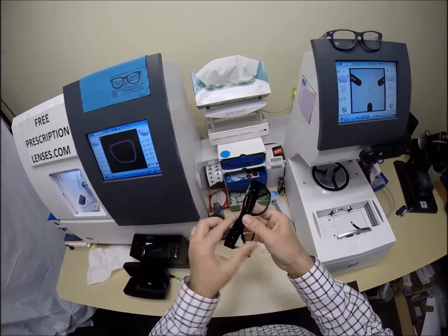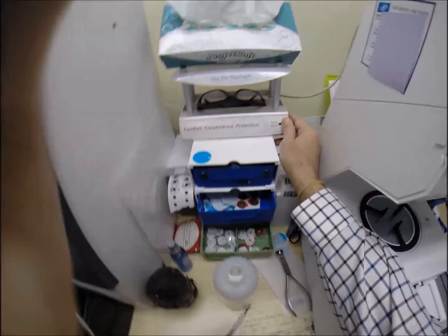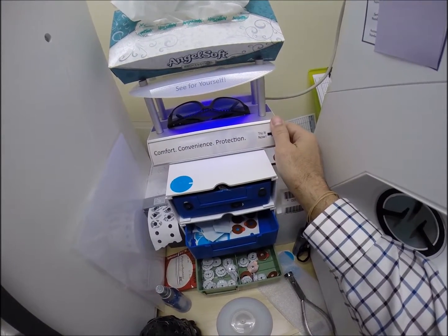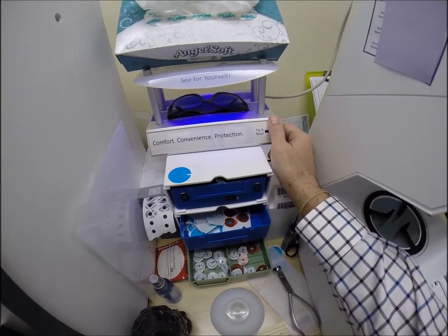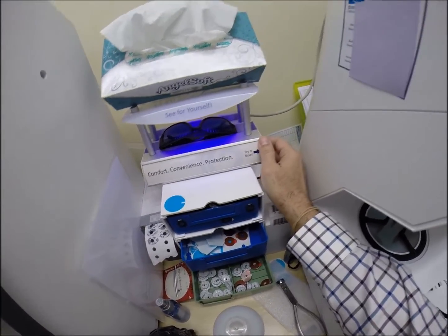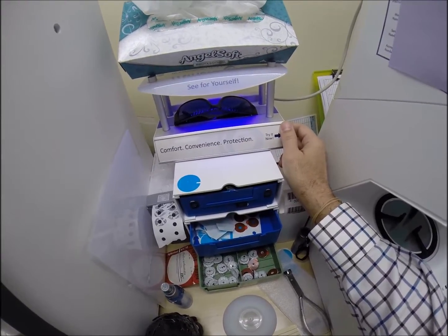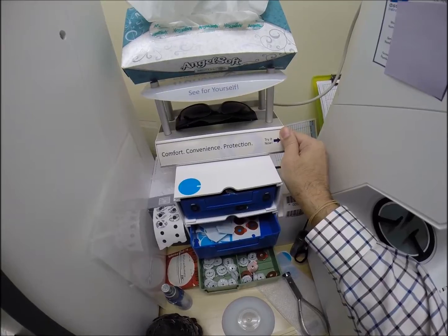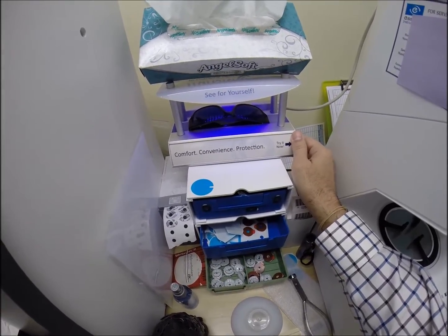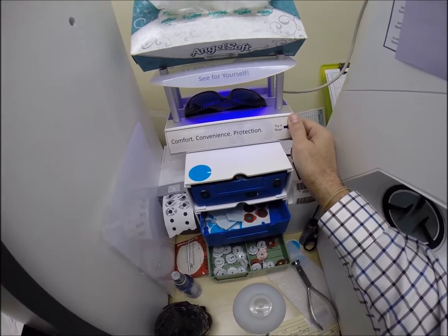I'm going to go ahead and activate them, meaning I'm going to expose them to a strong burst of UV light. Now, as you can see, it takes about 30 to 45 seconds for transition lenses to darken. It takes a little bit longer when you come back inside, 45 seconds to a minute 15 to return to virtually clear. This is important. All transition lenses will get dark on day one, but given 2 weeks of exposure to the sun, they're going to continue to darken every day for the first 2 weeks until they reach their final exposure. After that, they will work for years at maximum performance.